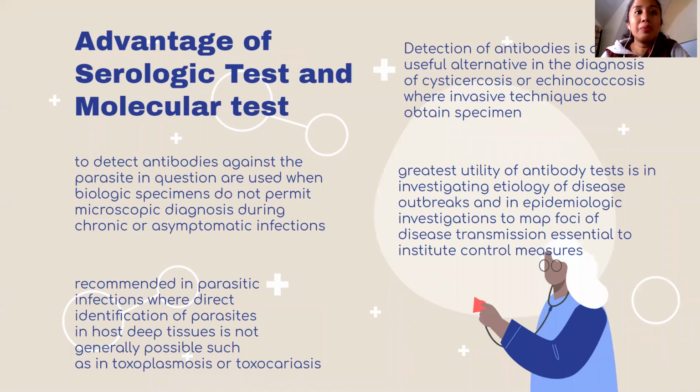Sometimes, some infections do not exhibit symptoms, or sometimes it's so chronic already, yan, that we cannot get another biopsy. Yung may mga limitation, class, kasi hindi naman tayo pwede kumuha ng specimen. May risk factors rin involved. So, we could use serologic test.